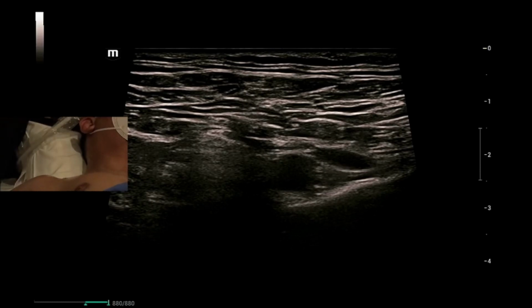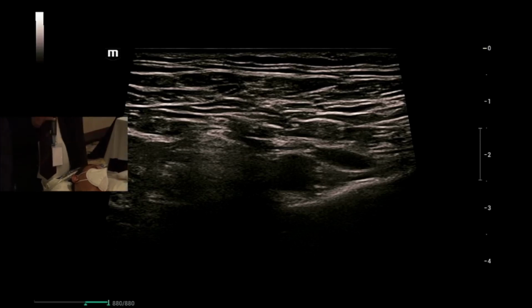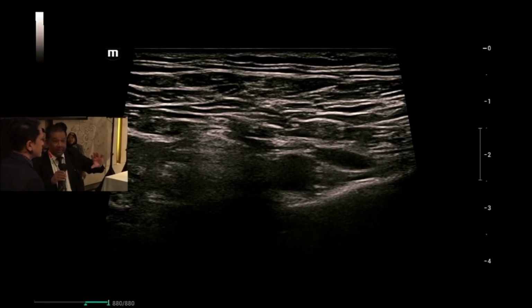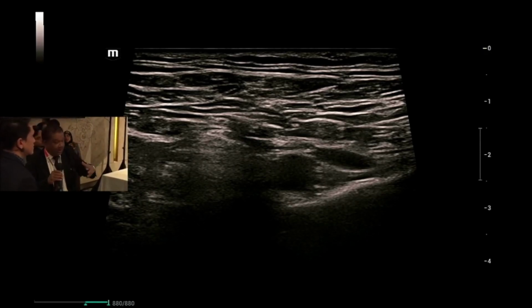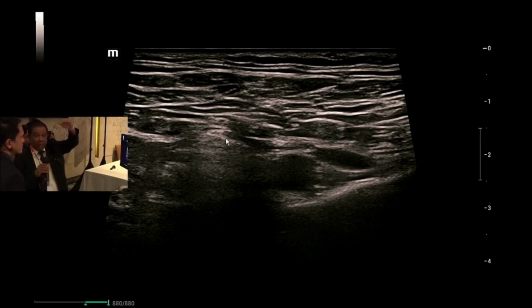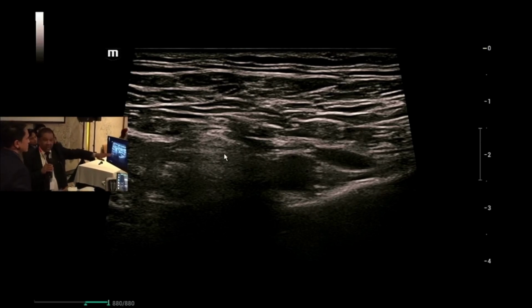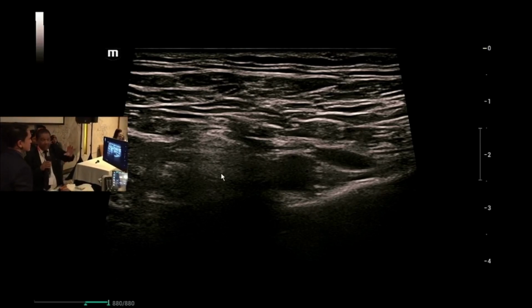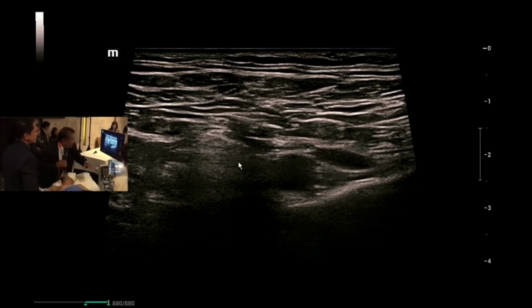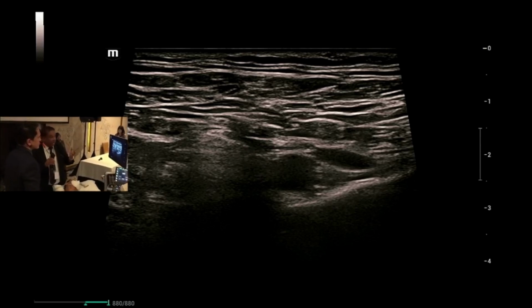This is an arrangement that is very consistent across patients, very consistent from person to person. But if you look at it more critically, actually it's a two-story building. Okay, there's a fascial layer, a septum, where the lateral cord, imagine it's on the upper floor, and the posterior and the medial cord are on the lower floor. Now, it doesn't really matter from an injection point of view because we are performing the injection at the center of the nerve cluster, okay? So we will direct our needle somewhere over there, place our needle with hydrodissection and perform the injection.